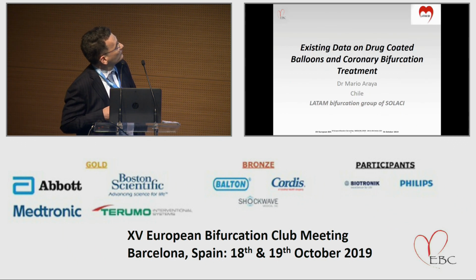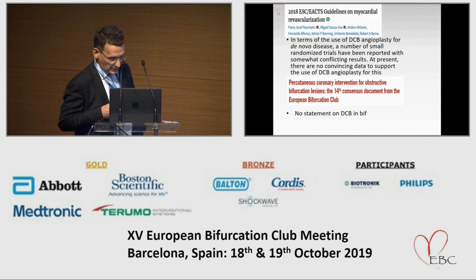Dr. Araya gave a talk on drug-coated balloons and coronary bifurcation treatment, first stating, as is the fact, that neither the European guidelines on myocardial revascularization nor our own consensus last year show any endorsement of the use of DCBs in bifurcation treatment.